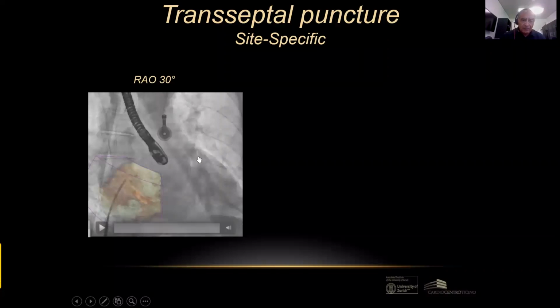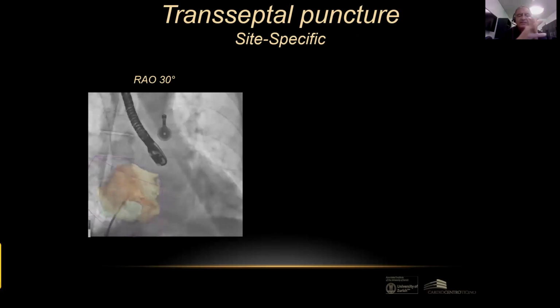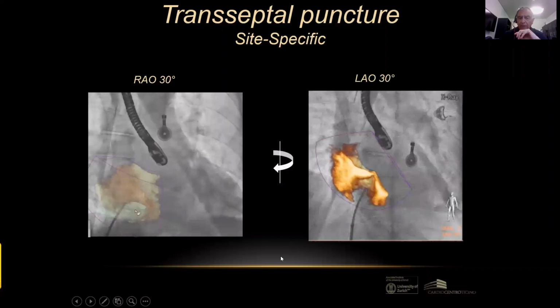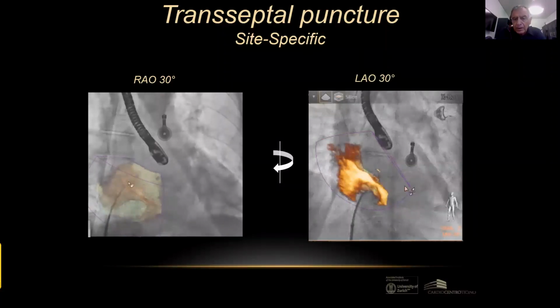You see, this is the fusion images. The fossa ovalis is here, the catheter is here, and this is exactly the position at around 30 degrees. So you have the fossa ovalis en face. And then you can see here when the catheter goes down, down, down until it reaches the position. Once it's stable in this position, we ask the interventionist to go in long axis, rotate the images, and then we have the tenting, as you can see here. In my opinion, this is the safest method for crossing the septum without any damage and to make a site-specific puncture.